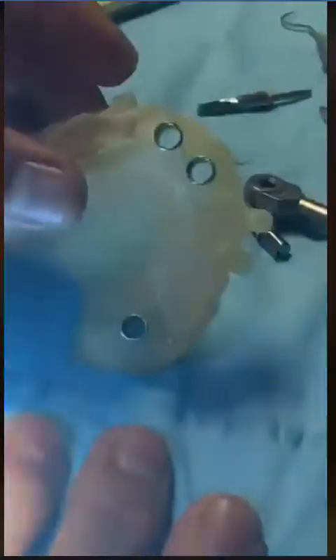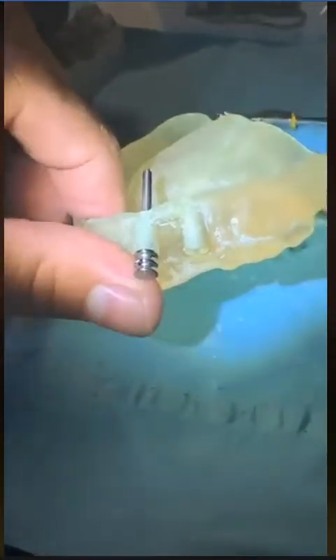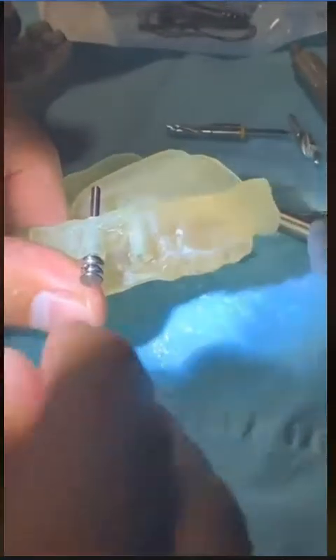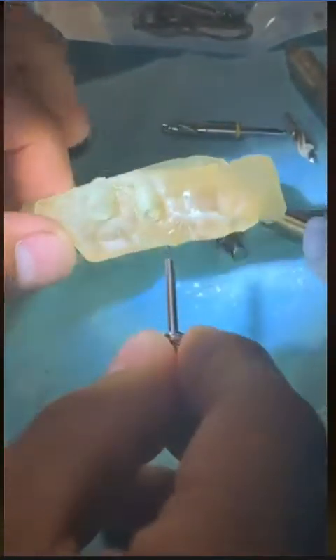Now let me show you a case that we did yesterday, and here is the guide for this particular case. Now one of the things that we do is that we create this fixation pin. Now the company gives us fixation paralleling pins, which basically fit inside. And I was planning, we're printing out the patient's jaw, but we ran out of time and it's not ready yet. But I was going to demonstrate that on the patient's model for you today.